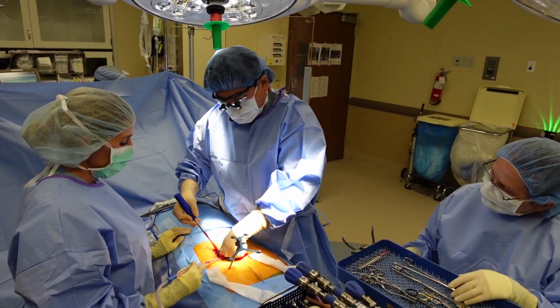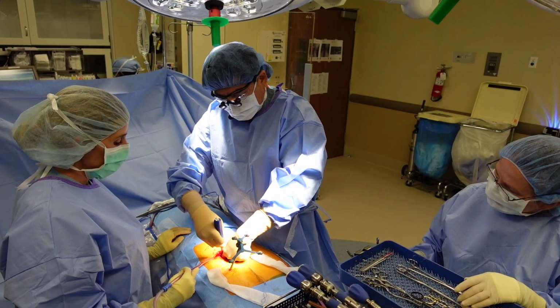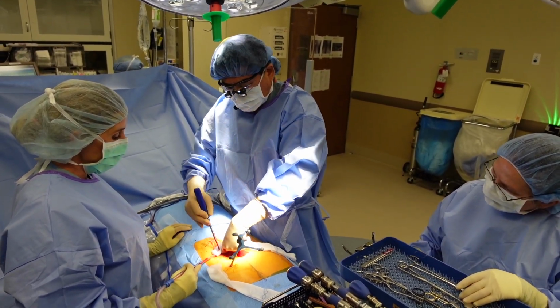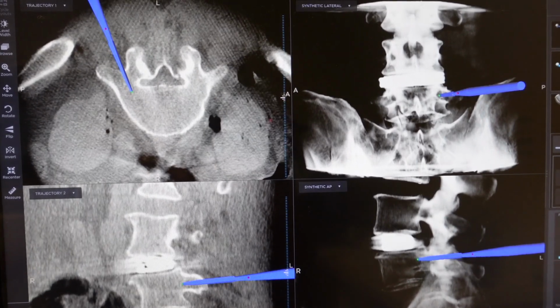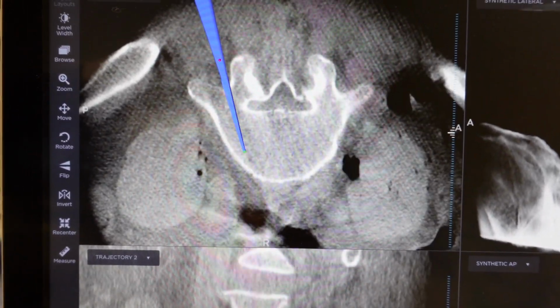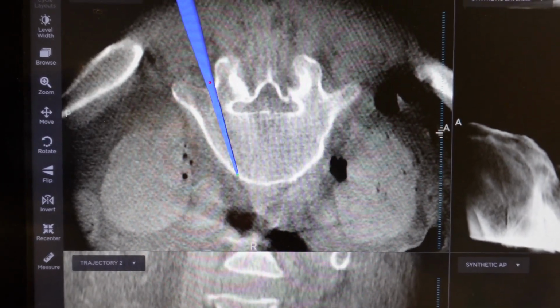The facet joints are unbelievably arthritic, which makes perfect sense. Alrighty, so I made the perfect starting hole, and now I'm using the thoracic probe to find my way down this bony tunnel called the pedicle. And you can see it just invites me in.